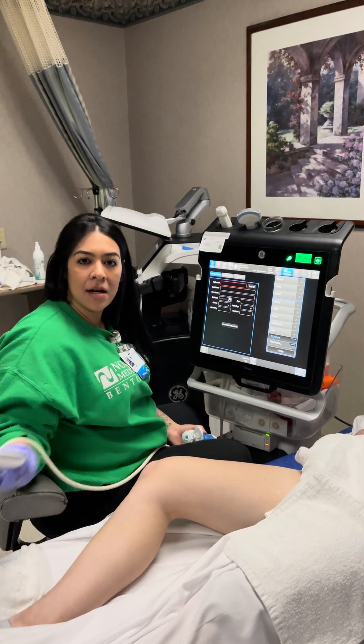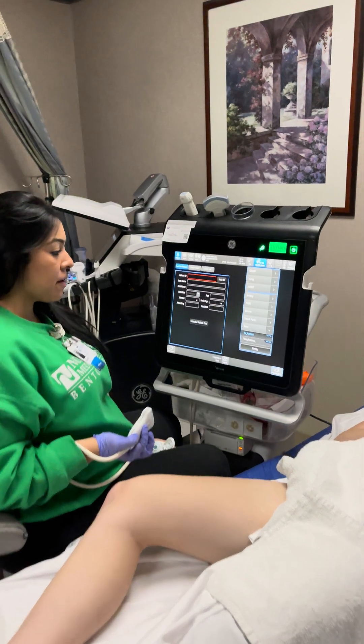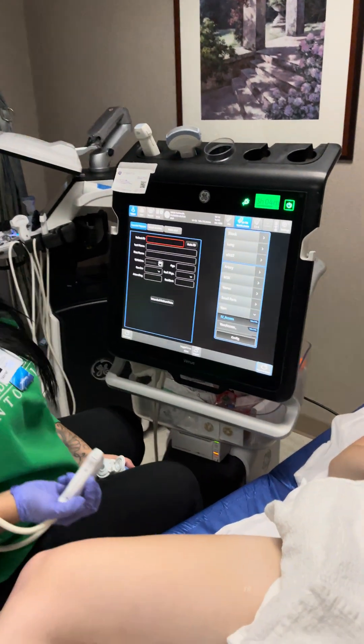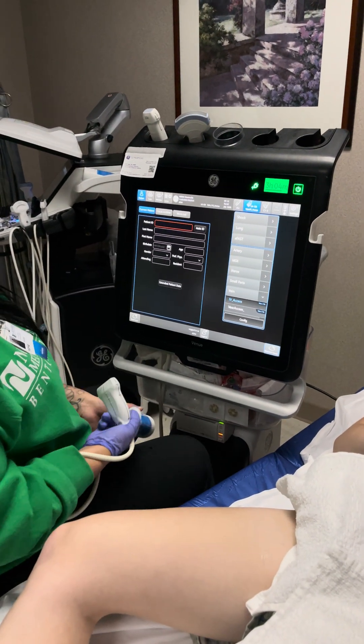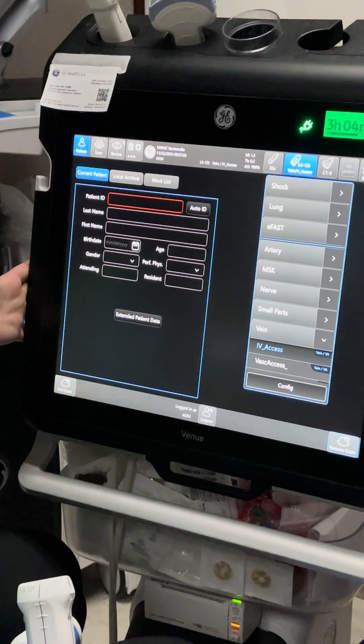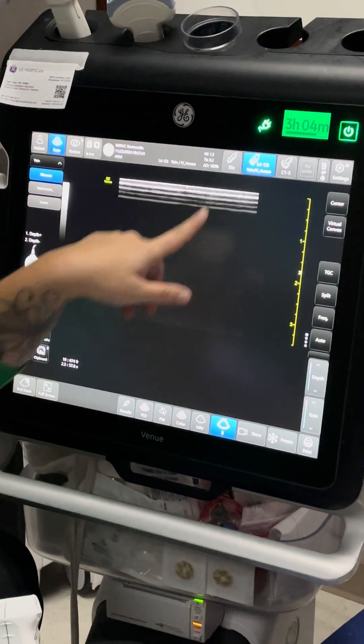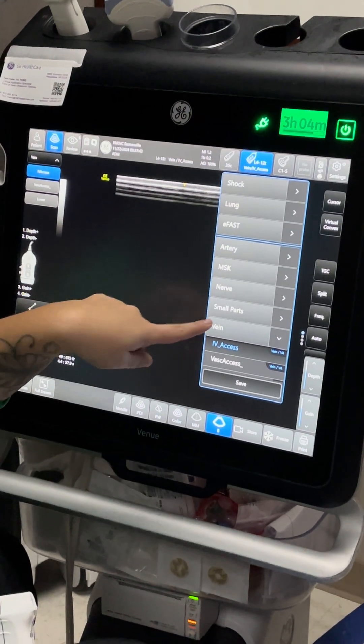Hey, it's Taryn again, and today we're going to go over a vascular study. We're going to look at her veins to rule out blood clot. We're starting on our patient information screen, pulling up our patient, then selecting our scan button and our probe and study. We're going to do vein.